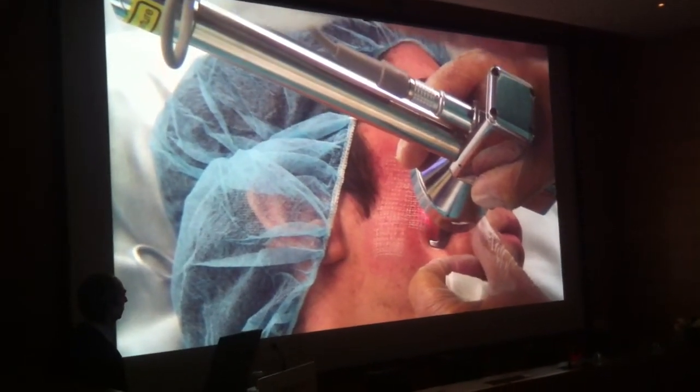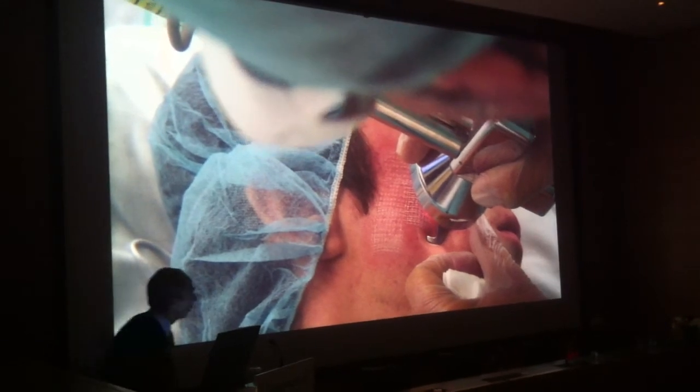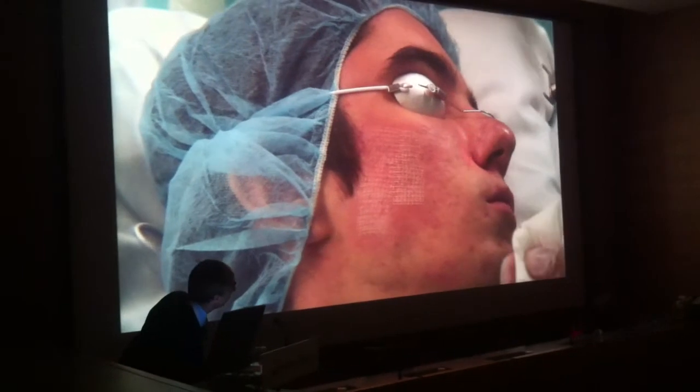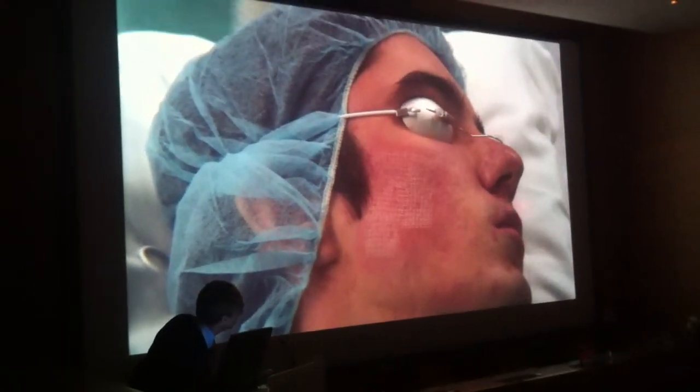And I don't know how much time we have left. We are almost out of time. Will you show us the feathering technique you're going to use, or should we stand now?